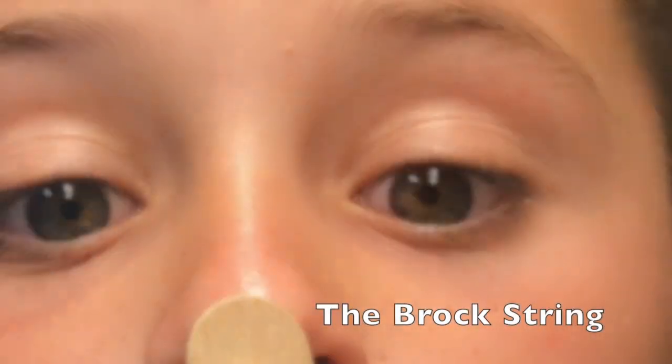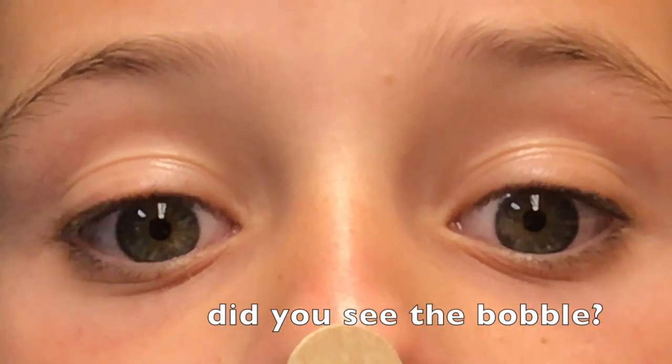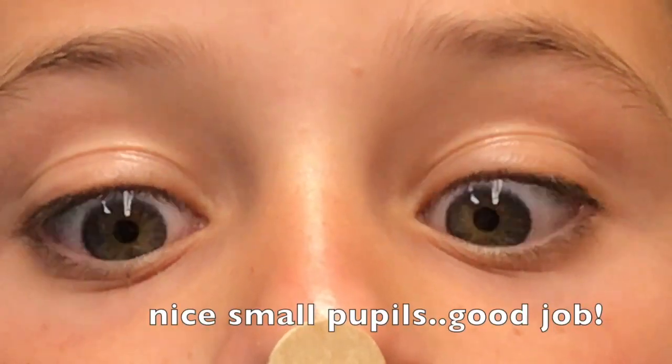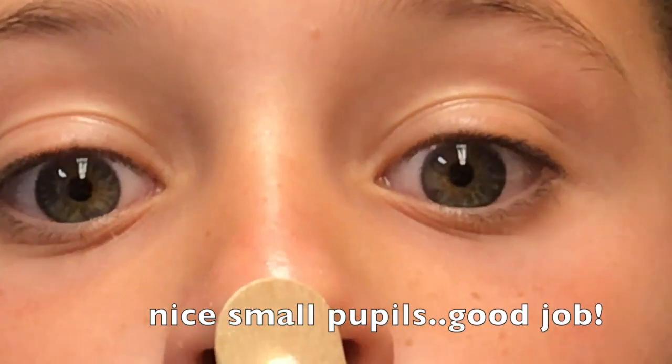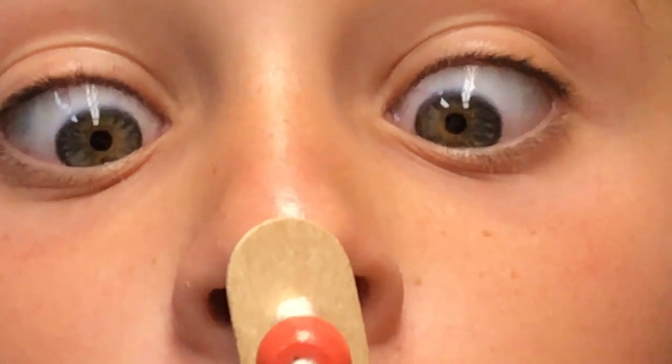Let's take a look at a close-up of some eyes working on a Brock string at the blue one and the yellow one. You'll notice in the video that as the eye started to fatigue, we see a little wobbling as we go far and back in. You saw that on a couple of the cycles as she went in and out — that's going to let you know this area is still a little weak and we need to continue to work on it.